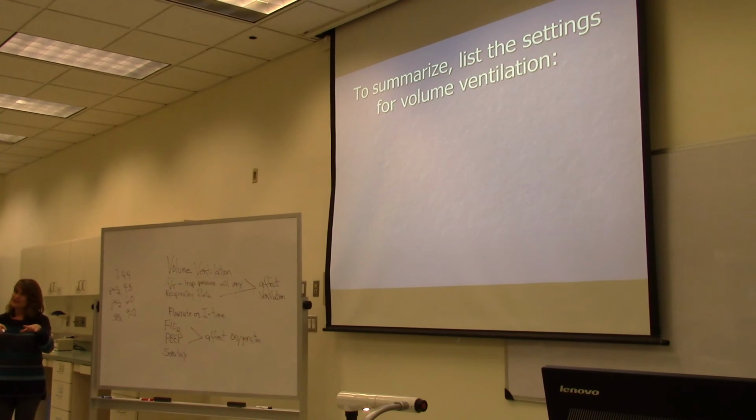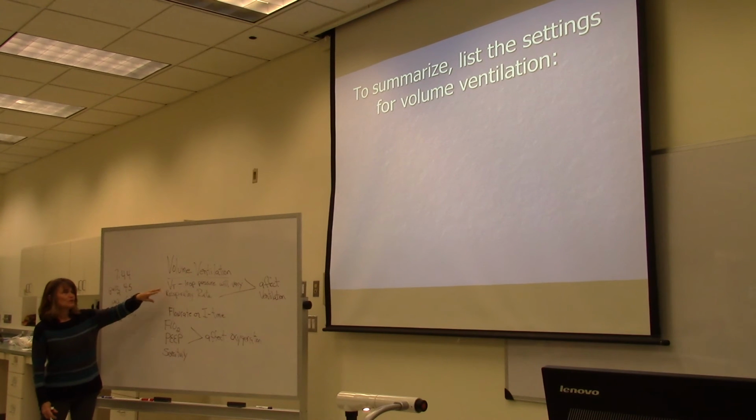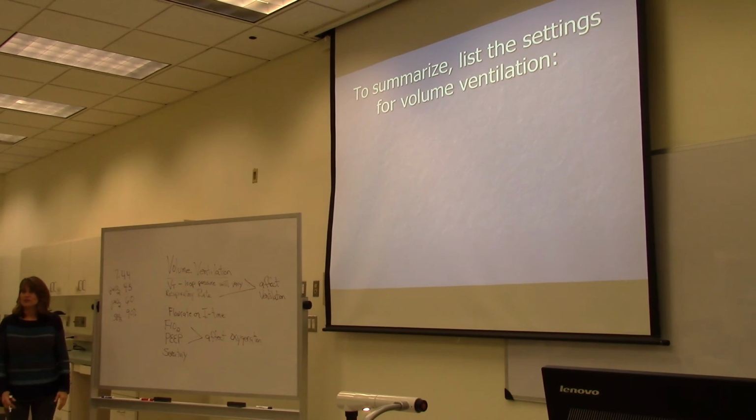So that's different than a patient on a ventilator. On a ventilator, we're always providing minimum ventilation. So it'll never be that the ventilation goes so low that it affects oxygenation. So as long as you stick to these two, tidal volume and respiratory rate affect ventilation, FiO2 and PEEP affect oxygenation when you're making vent changes. Okay?